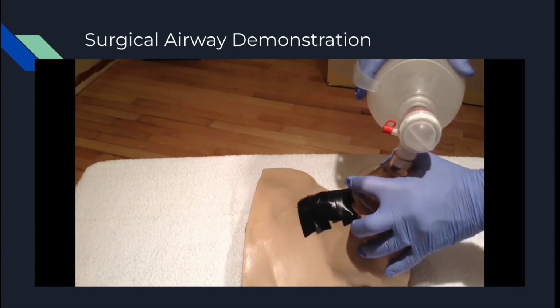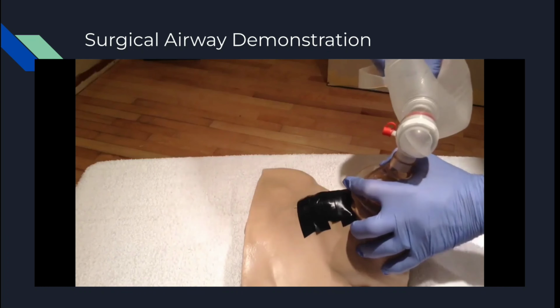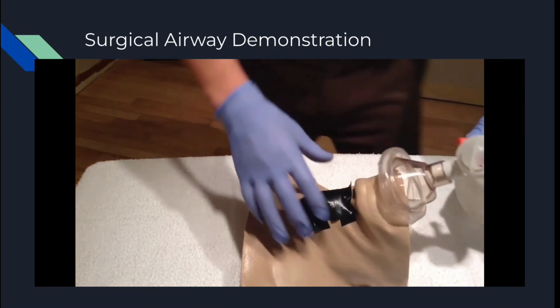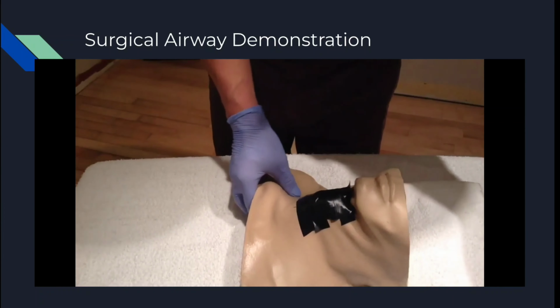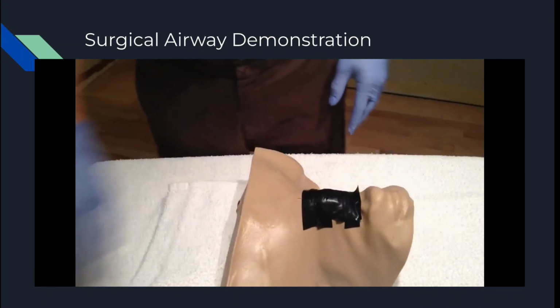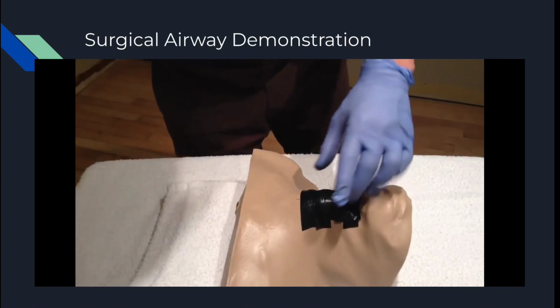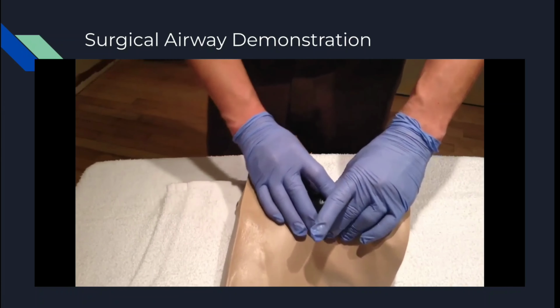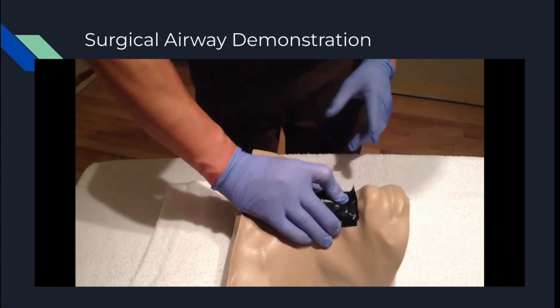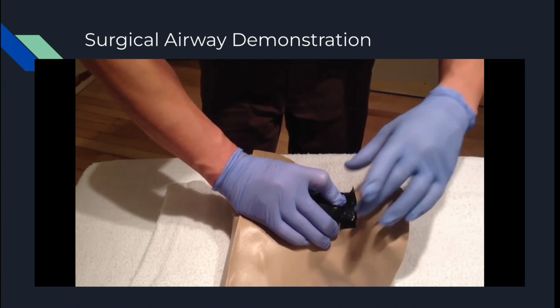Okay. So we can't intubate, can't ventilate. John, get ready to take over ventilations. Have everything ready there. Okay, go ahead and take over. We're going to hyperextend the neck to position better for surgical airway. Get the prep ready, please. Okay, thank you. Everyone get PPE on. Everyone face shields, please. All right. I'm landmarking here. You have the scalpel, bougie, 6 endotracheal tube lubed.